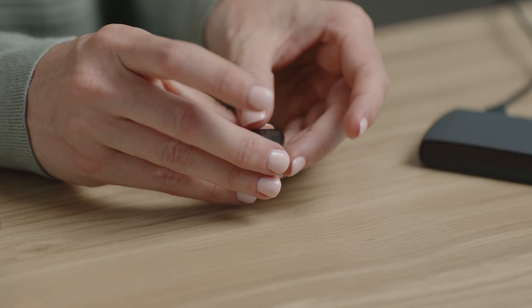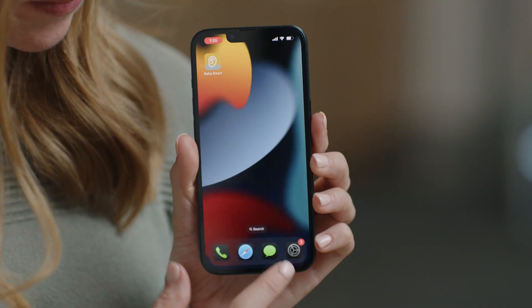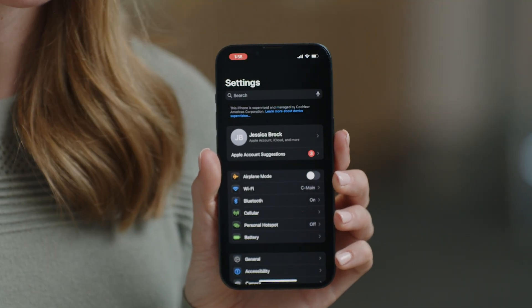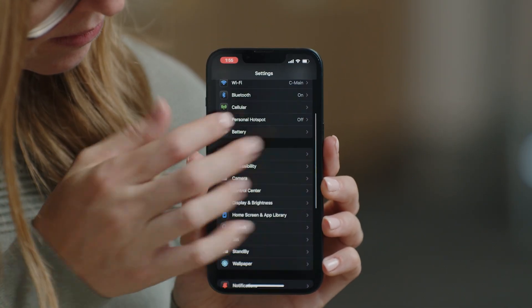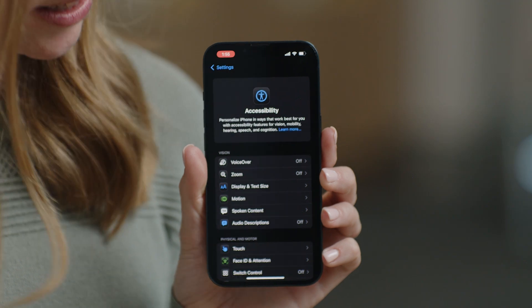To pair your Apple smartphone to your Baha 7 sound processor, start by opening the battery door of your processor. On your Apple device, go to Settings, Accessibility, and then Hearing Devices.